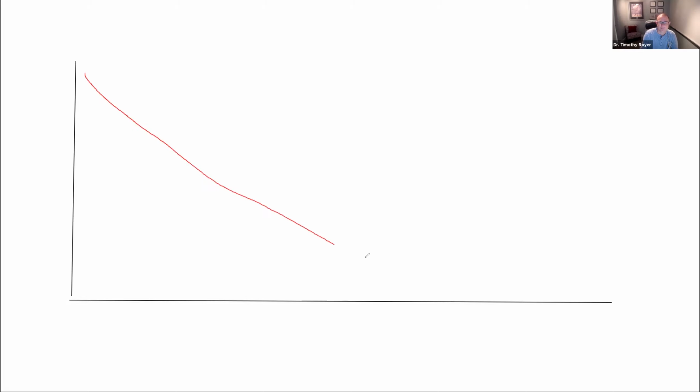So we've got our y-axis, our x-axis, and let's do our ideal line, which is going to be the slope that we calculated earlier. That's going to look like this. It tails off to nothing, and we're going from 0 to 32 hertz.